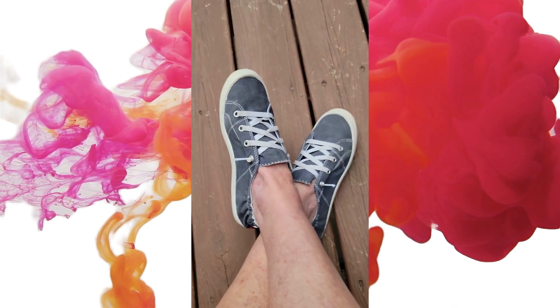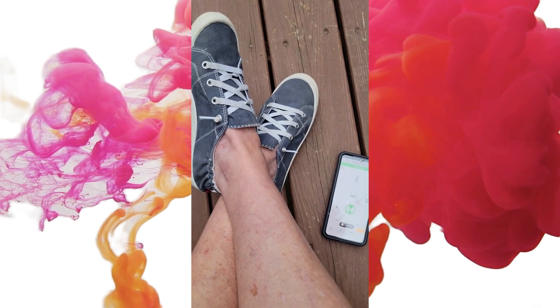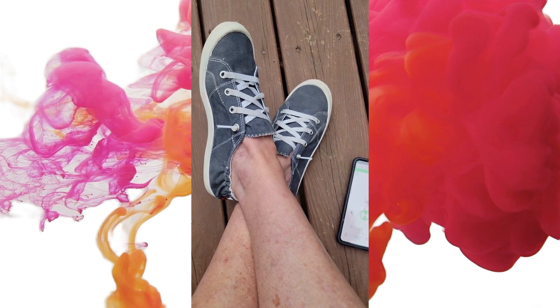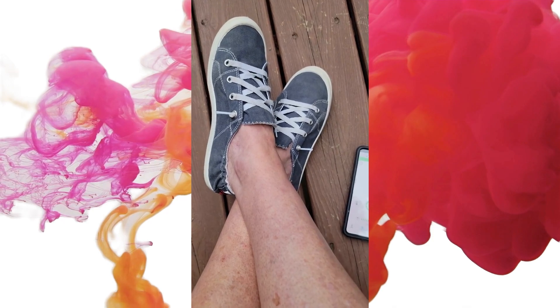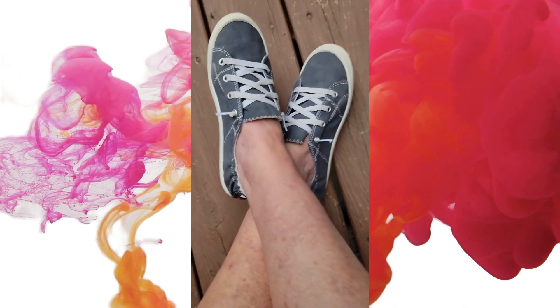You hear a sound, you see the foot begin to move. As soon as it stops, it just lets off. Now it's off. I'm going to increase the intensity to make the effect show up more.